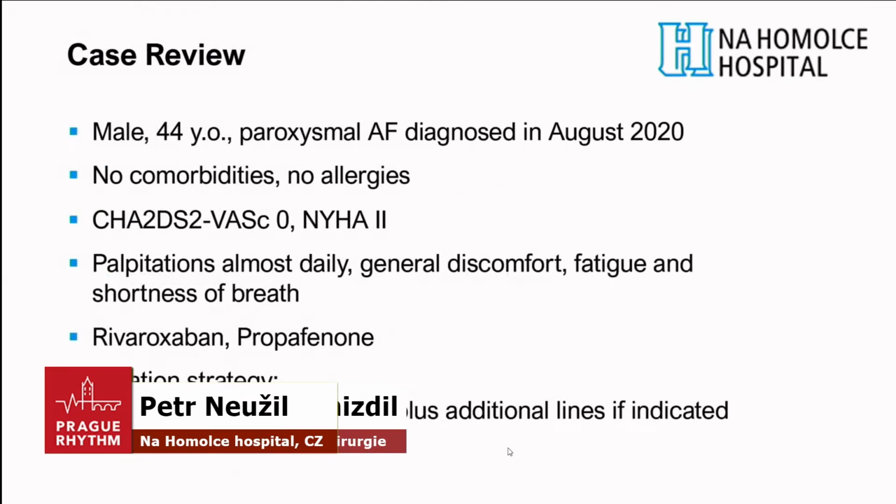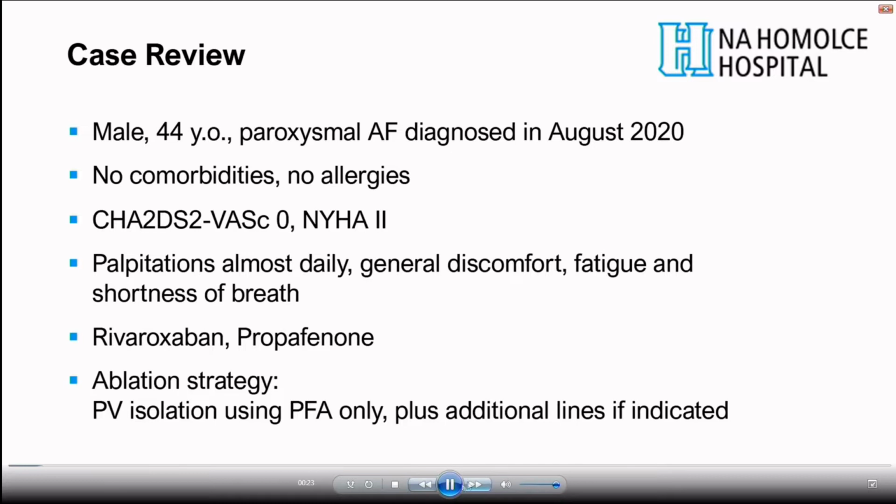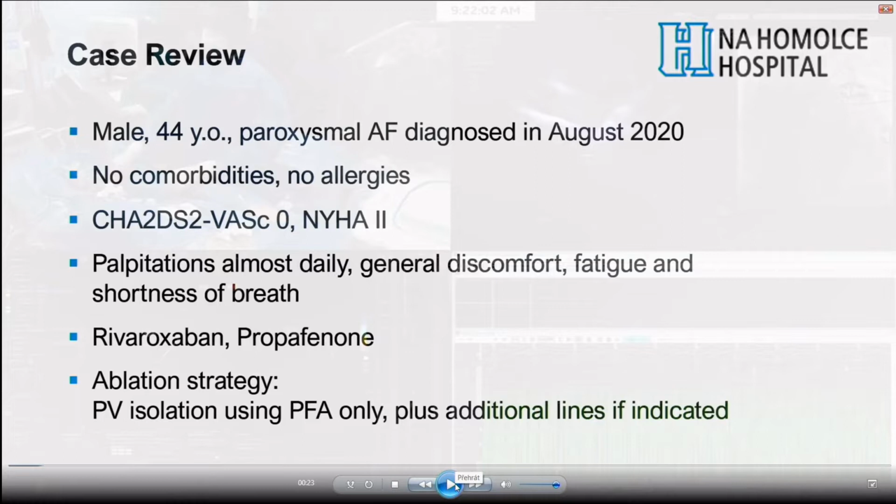It was recorded probably in November or December. This is a 44-year-old man with paroxysmal atrial fibrillation. As things were not clear, the plan was for paroxysmal atrial fibrillation, and when the protocol is open for other lesions, not only PVI, we got what we got. You will see very clearly that it was not only paroxysmal atrial fibrillation.